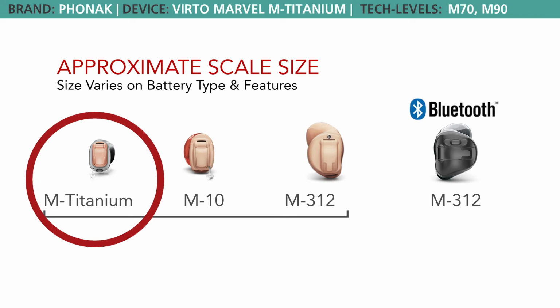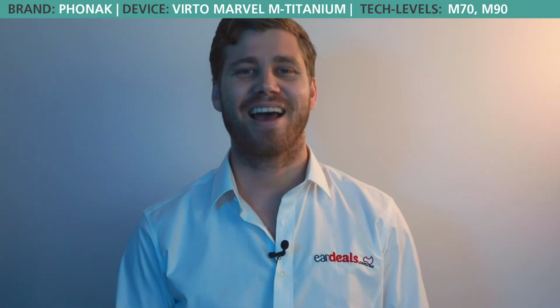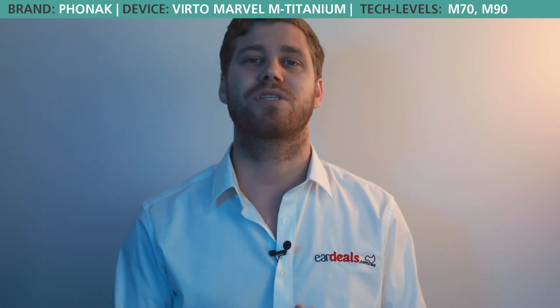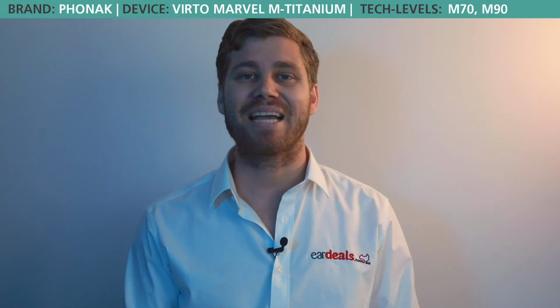As a result of this, the hearing aid is more discreet, which moves us into colour. I'll start by saying that a lot of people who choose this style are concerned about the size of the hearing aid and it being discreet, because it is considered a style that's more discreet than others on the market. As a result, what I say to people here is choose the colour based on your hair or skin tone, because it will make it more discreet.